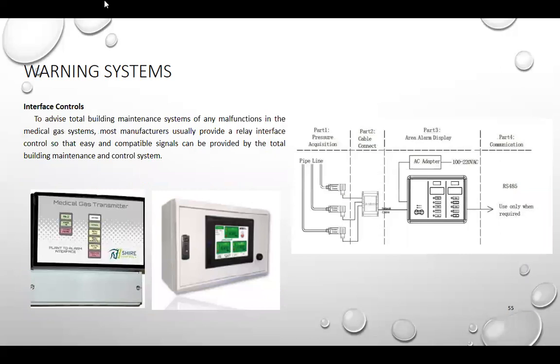Interface control. Interface ngayon, to advise the total building maintenance system of any malfunction in the medical gas system. Most manufacturers usually provide a relay interface control so that a compatible signal can be provided by the total building maintenance and control.